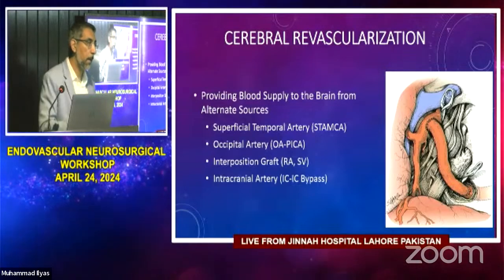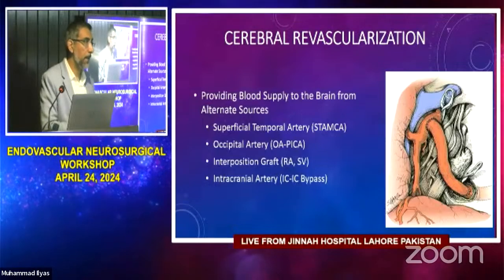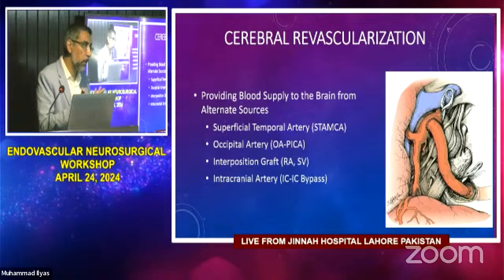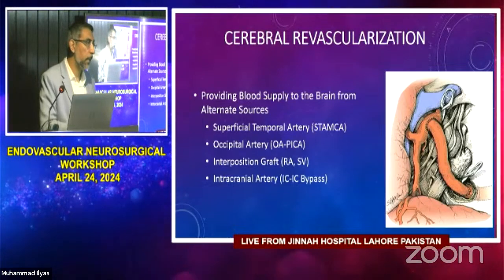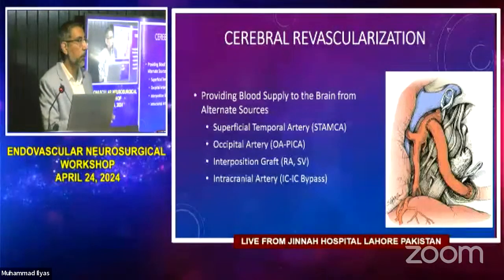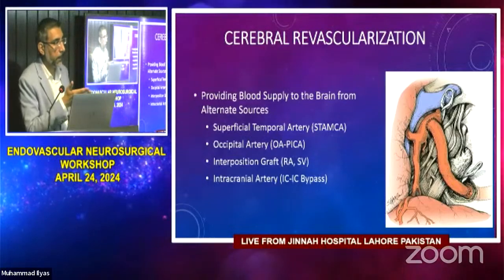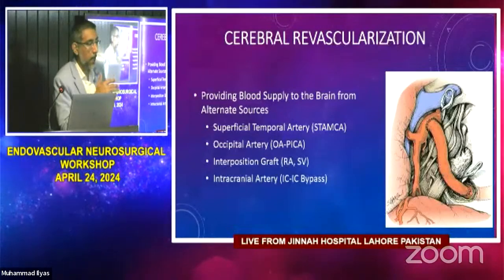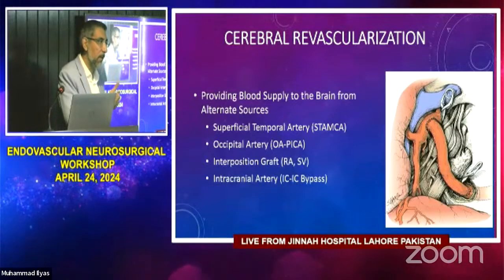Right now I'm part of a registry. We're collecting cases across the country. Once we have enough cases, we can apply, because CCF in our part of the world is not super common. We're trying to go for what's called a humanitarian device exemption, where it's not completely on label, but to use it, we don't have to fill out the paperwork. When I had to use this, I had to fill out a bunch of paperwork, and people came back to me from the FDA and said, okay, do you have any other good option? Can you pipeline and coil it, this, that? I had to go through all those acrobatics to be able to use this device. That would be sort of the trial.